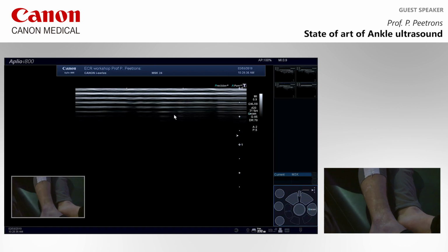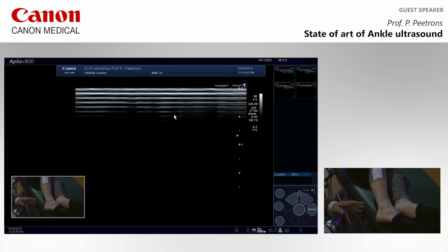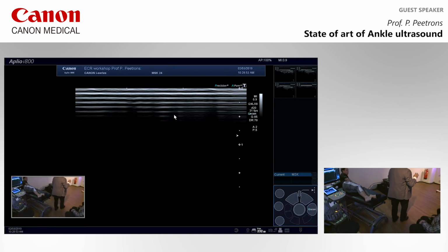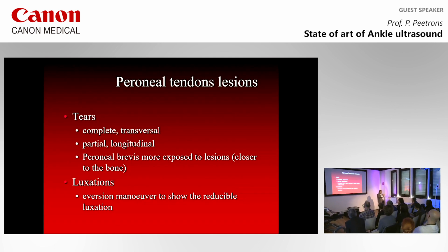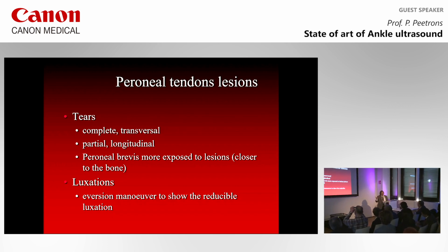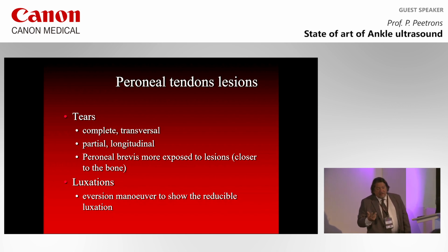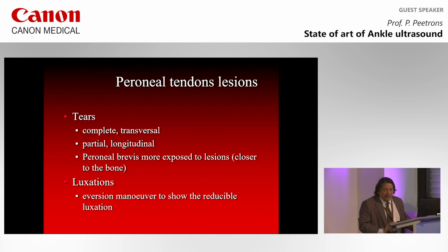And if you don't see anything in the ankle, don't forget that in recurrent sprain, so this is not the first sprain, it is coming after 5, 6, 7 little dislocations, okay? The patient is just, oh, it hurts. And then she, or he, says that the pain is not precise in the ankle. It is going to the foot, to the dorsal foot. Of course, the dorsal foot is innervated by the superficial peroneal nerve. Then you have to think about looking at this. If you see a neuroma, you inject the neuroma with anesthetic first, or with steroids, as a therapeutic test, and then the patient says, "Oh, I don't feel anything anymore," and you are the hero of your hospital, okay? Because he or she has already been injected 5 times around the tip of the malleolus without any difference, okay?